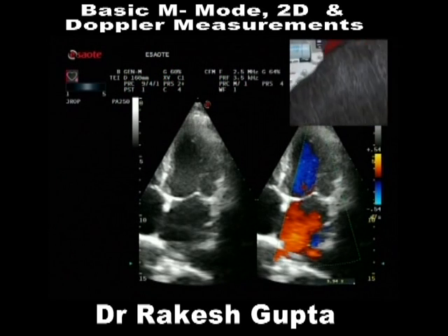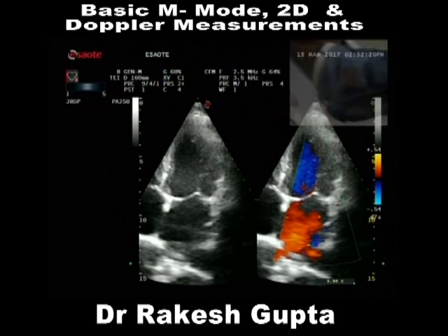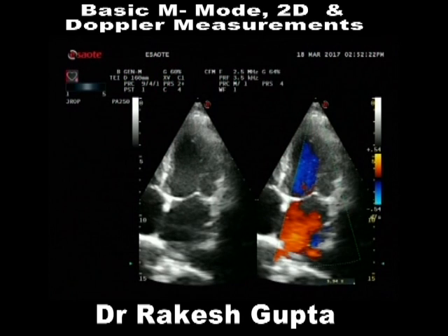Meaning to say this, as we reduce our hertz, we will have poor imaging quality. As we increase our hertz, we have good imaging quality. Clear or not clear? We spent almost an hour on knobology and these things. Okay, shall I move further now?